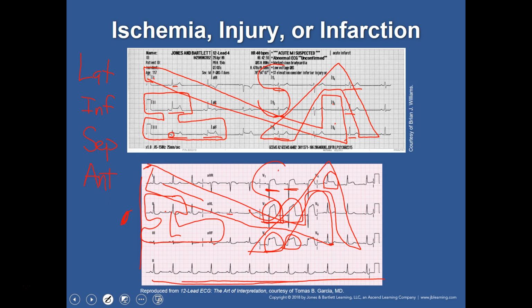So now, earlier when I talked about how sometimes you get these crossed up, meaning mixed in together, I don't know what the right word is. Crossed up is probably not it. This is one word though, anteroseptal.